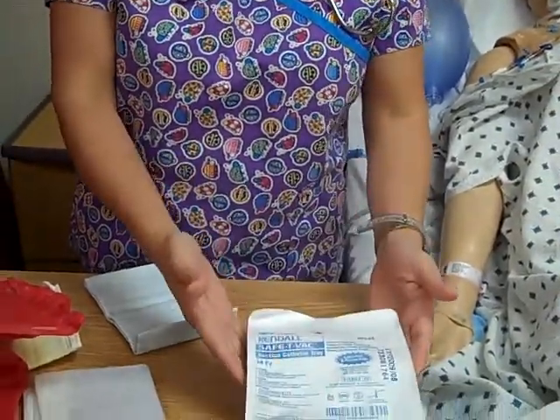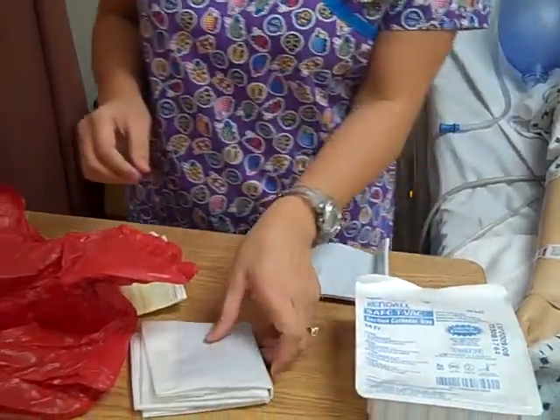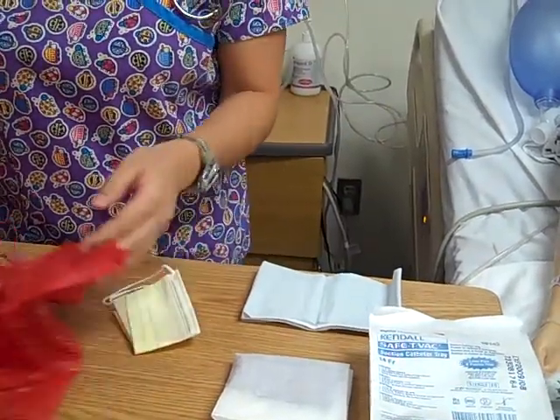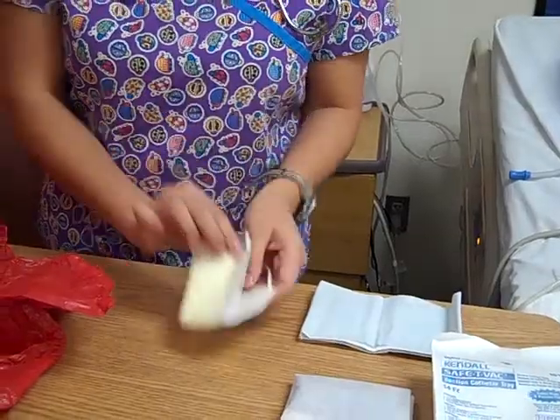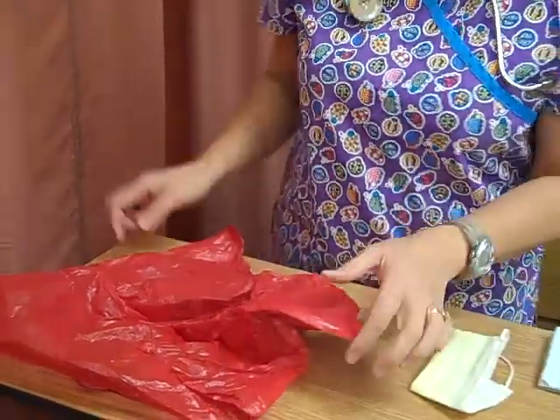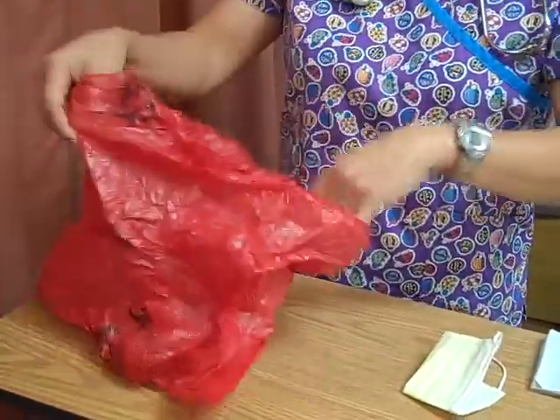You will also need a suction catheter tray. You will need a towel to place on your patient. You will also need an extra pair of sterile gloves — always bring that with you when you are doing a sterile skill. You will want to bring a face mask for yourself. If your protocol calls for it, you will need a saline bullet, and you will also need a red bag for your dirty supplies.